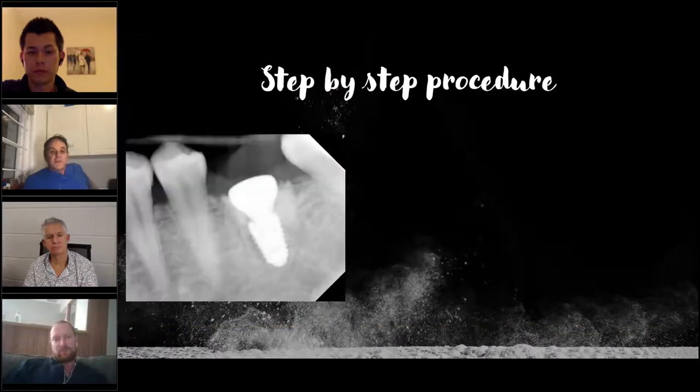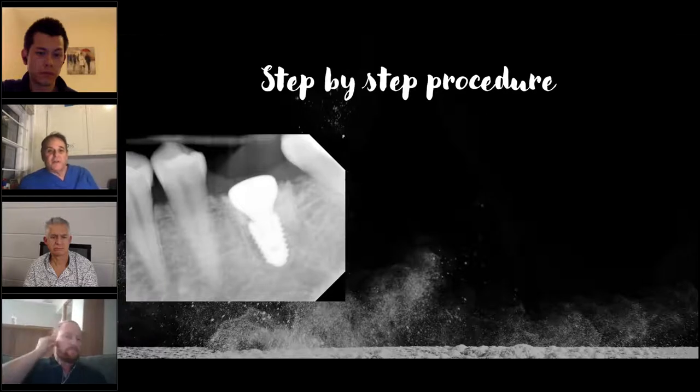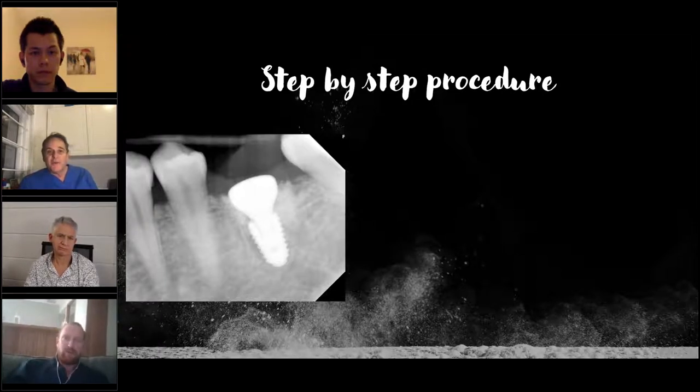So it's interesting to see the case here, because I don't know if you've used the Cervico system by another Greek. The Cervico, and there are a lot of different options in this. It's a nice customized closure. And again, we've been using more and more of Cervico, and been getting really good results, and I think it's a really clever design as well, which helps you plan the placement into a better position.